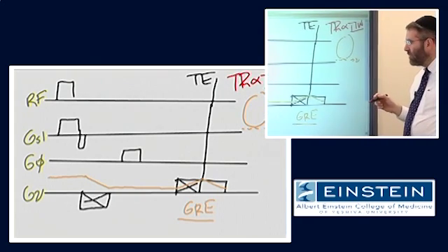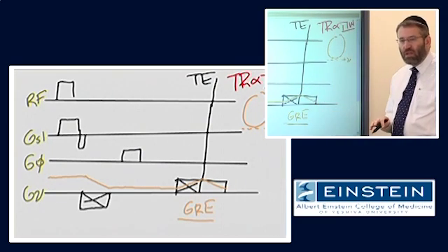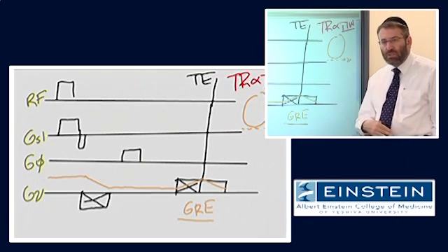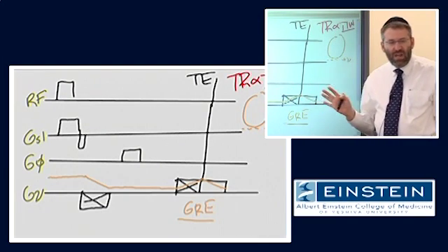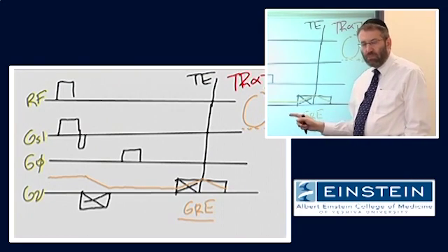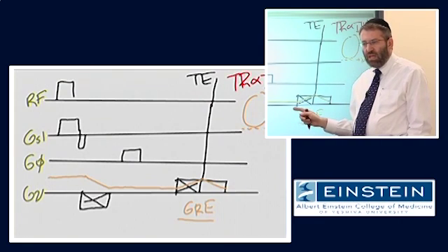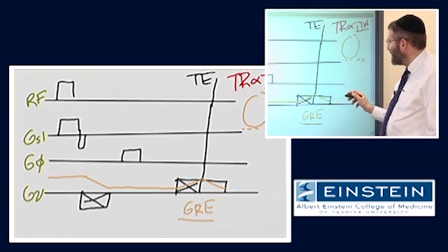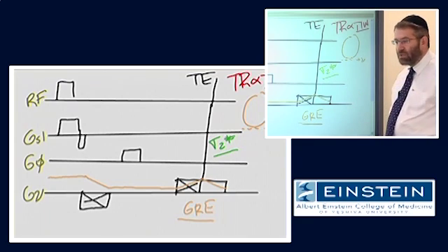And generally, whereas it seemed on Monday like the way that we modulate T1 contrast is by adjusting the TR, and the way we modulate T2 contrast is by adjusting the TE, in gradient echo imaging, TR is sort of not a factor. Right? T1 contrast is modulated much more, and I'll show you this right now, modulated by the flip angle. And it's gradient echo, there's no 180-degree RF pulse, so strictly speaking it's not T2, but it's T2 star contrast, right, is still modulated by the TE.